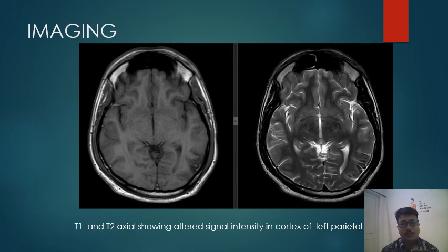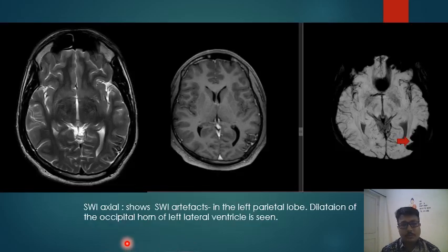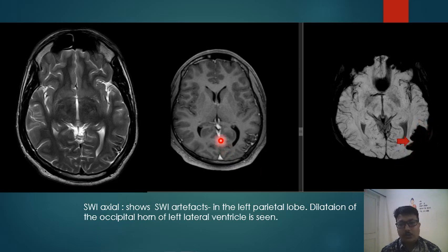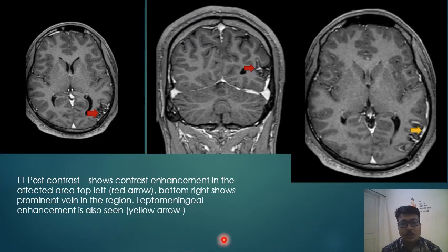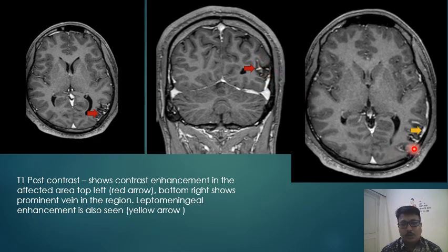On imaging, T1 and T2 axial images show altered signal intensity in the cortex of the left parietal region. On susceptibility weighted axial images, susceptibility artifacts were seen in the left parietal lobe in the form of signal dropout, identified by the red arrow, which signifies calcification. Dilatation of the occipital horn of the left lateral ventricle was also noted. On post-contrast sequences, enhancement was seen in the axial and coronal sections in the left parietal region, along with prominent veins and leptomeningeal enhancement, as indicated by the yellow arrow.